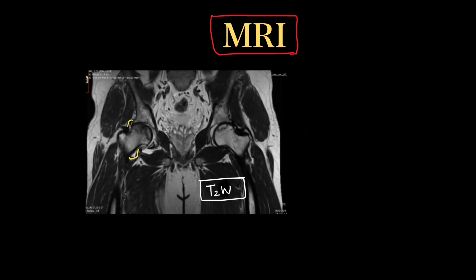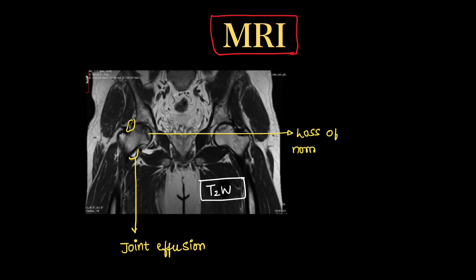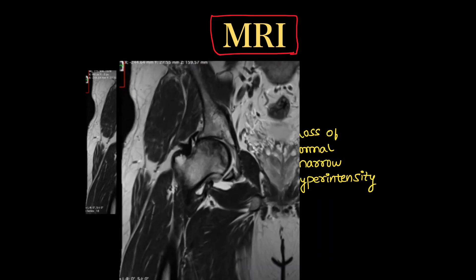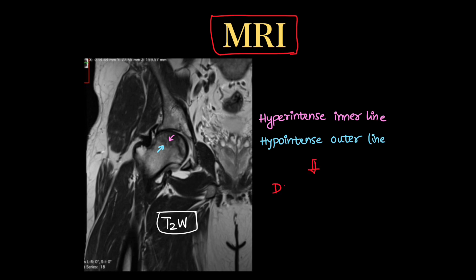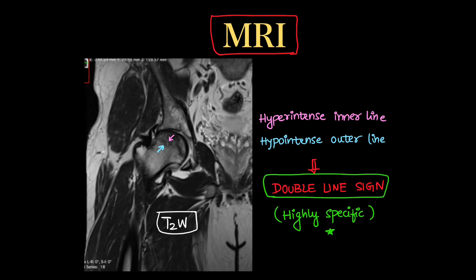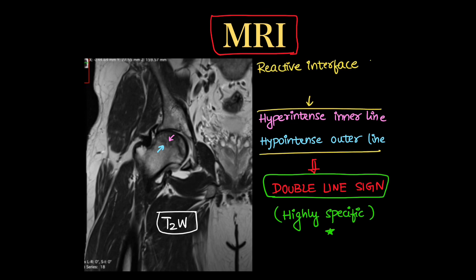On T2-weighted images, joint effusion around the head and neck of the involved hip can be seen, along with loss of normal marrow hyperintensity signifying edema. The most important finding is the double line sign: a hyperintense inner band along a hypointense outer line on T2-weighted imaging. This is highly specific for avascular necrosis of the hip and signifies the reactive interface separating non-viable bone from viable bone.